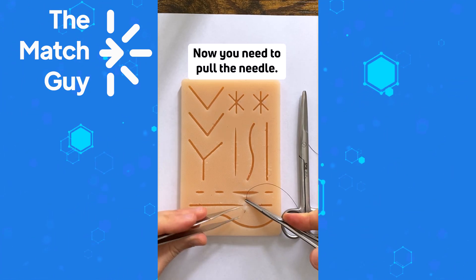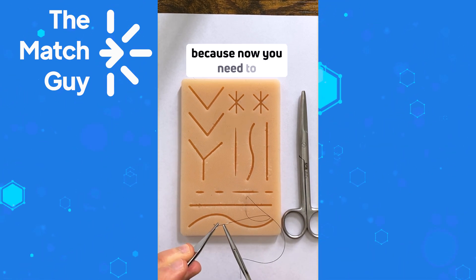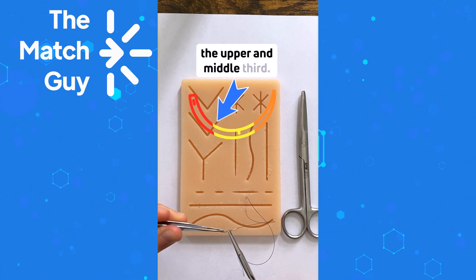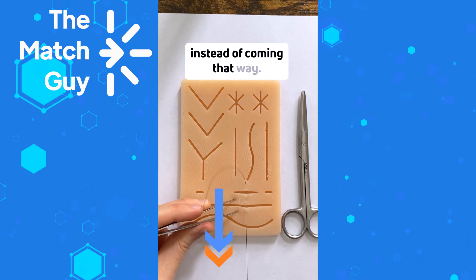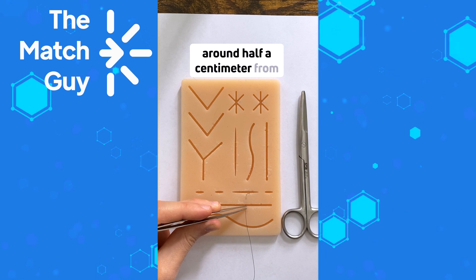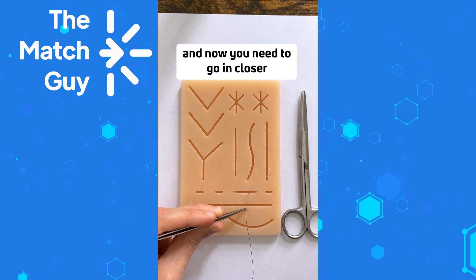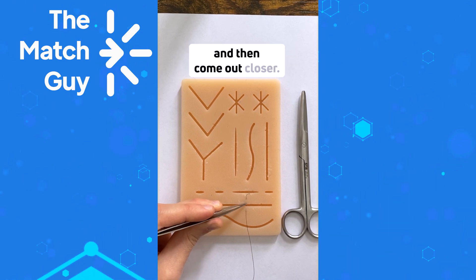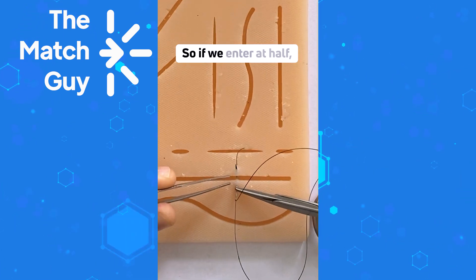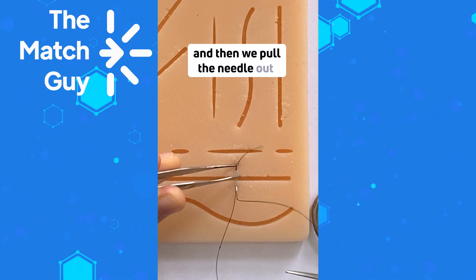Supinate your wrist and come out at around the same distance that you entered. Now pull the needle, and you have to backhand it going the other way. Hold the needle around the same position between the upper and the middle third, but now going this direction. Enter around half a centimeter from the edge of the skin. Remember, you entered far-far and now you need to go in closer — so if you entered at one centimeter, go in at around half a centimeter and exit at half a centimeter on the other side.